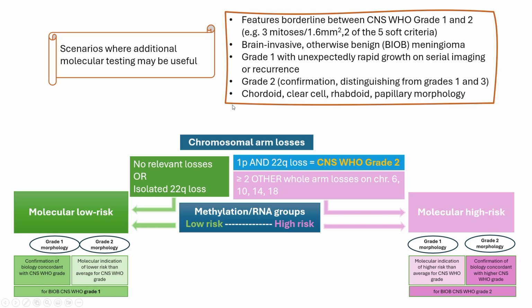What is completely new? These are additional scenarios where additional molecular testing of meningiomas might be useful. So this is probably our case, something between grade 1 and grade 2.